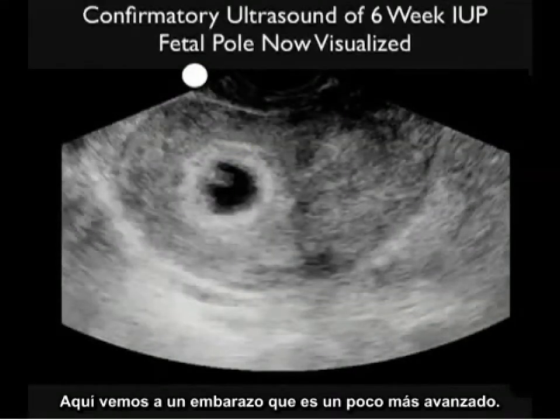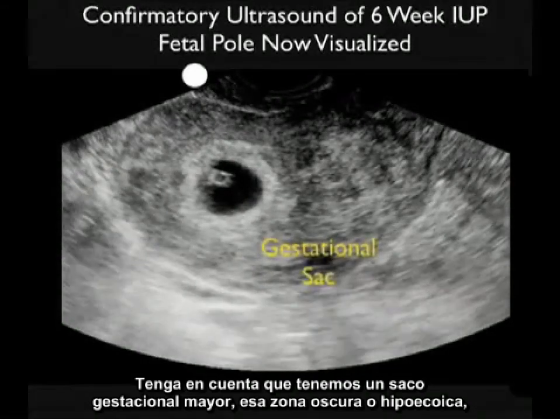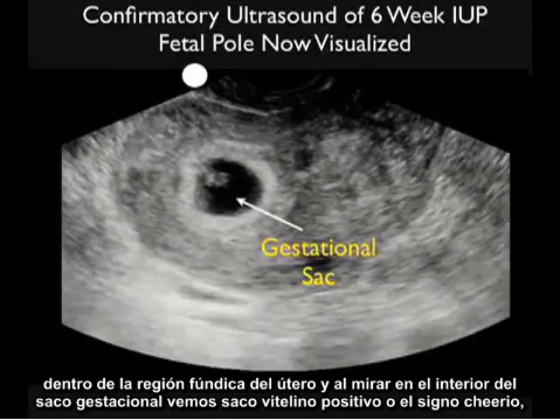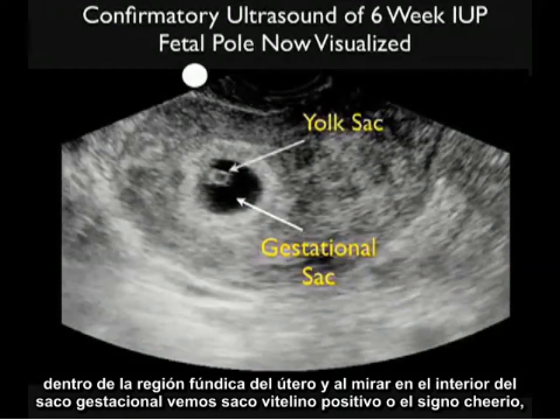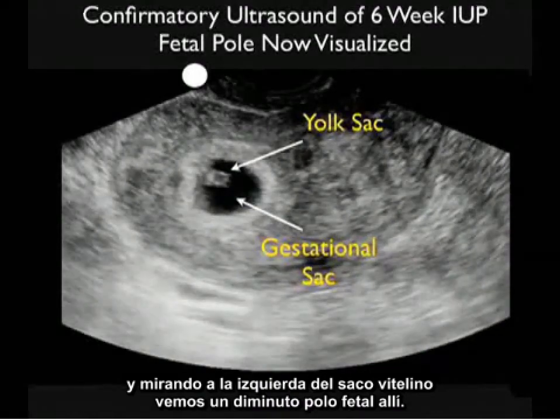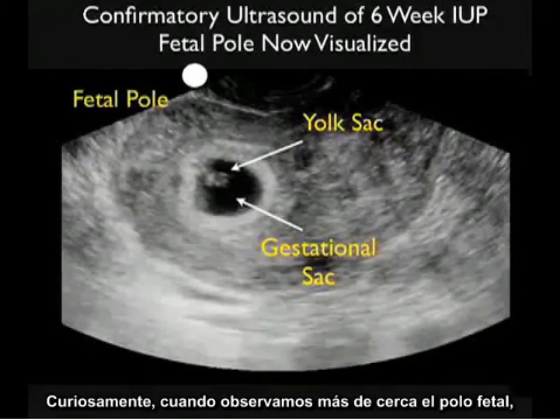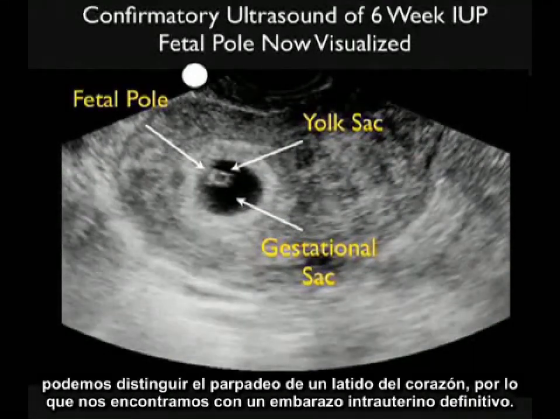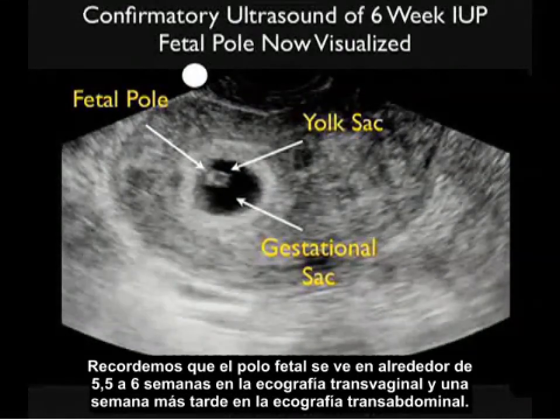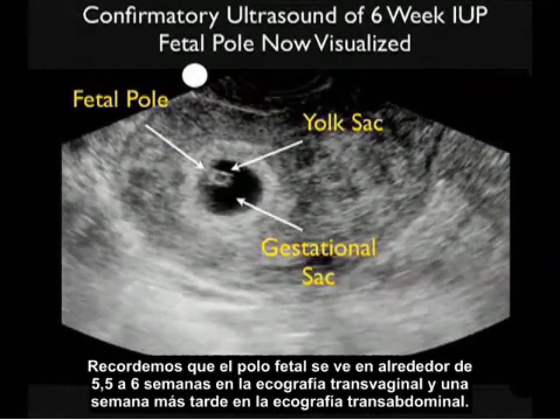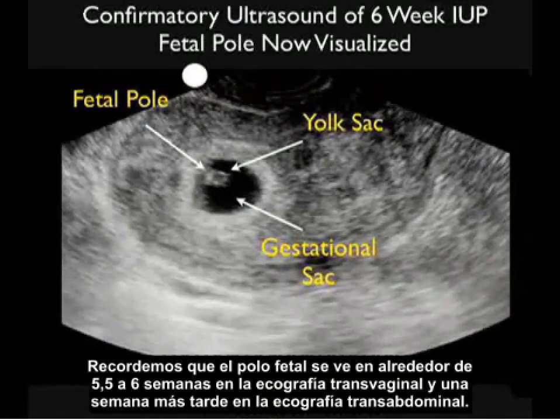Here we see a pregnancy that is a bit further advanced — a larger gestational sac in the hypoechoic fundal region of the uterus. Inside the gestational sac we see the positive yolk sac or cheerio, and just to the left of the yolk sac, a tiny fetal pole. As we zoom in on that fetal pole, we can make out the flicker of a heartbeat — confirming a definitive intrauterine pregnancy. The fetal pole is seen at about 5.5 to 6 weeks on transvaginal sonography and about a week later on transabdominal sonography.